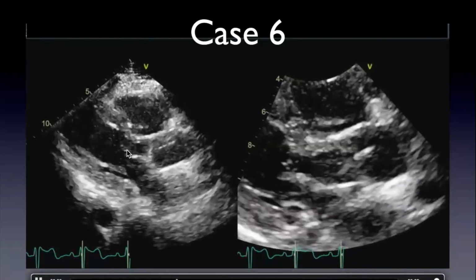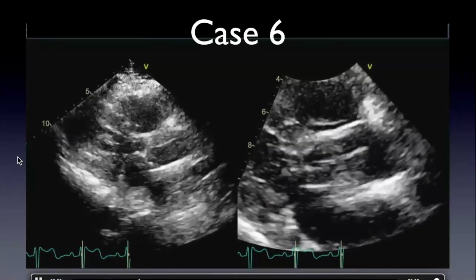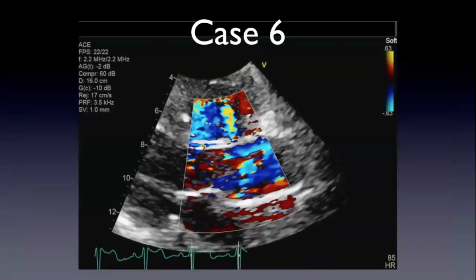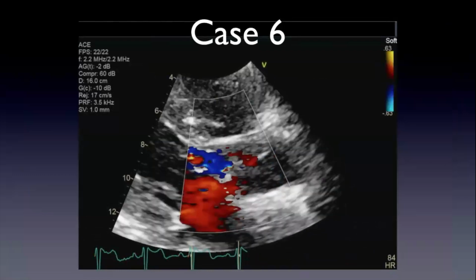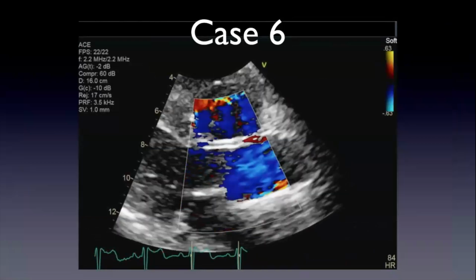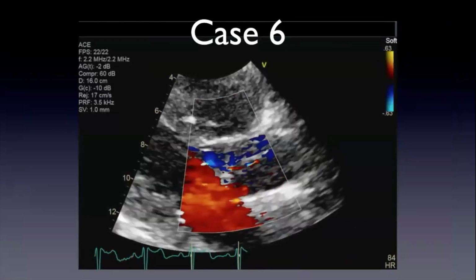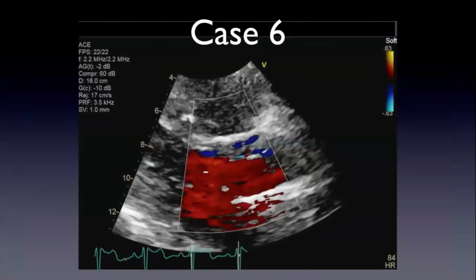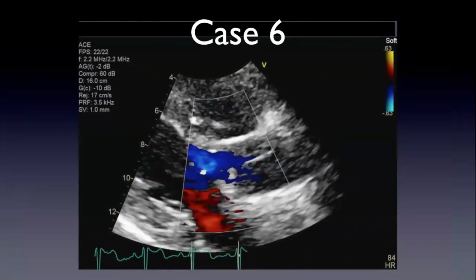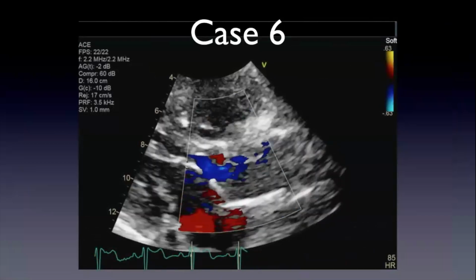Yes, the black. So keep an eye on that color. As usual, this is a GE color. And a touch over gain too, right? It's good color. It's useful to actually turn down the background gain in this case when you have the color on.